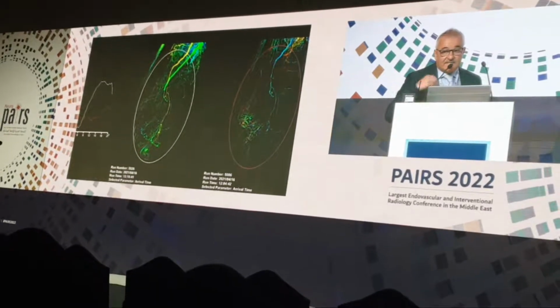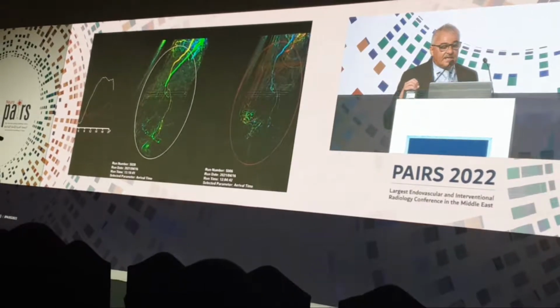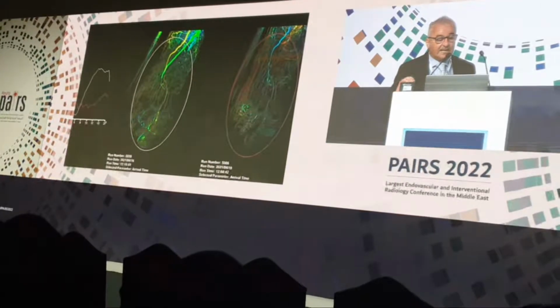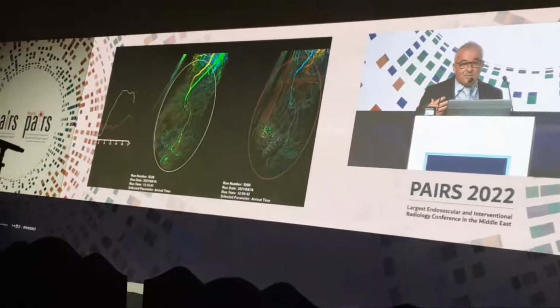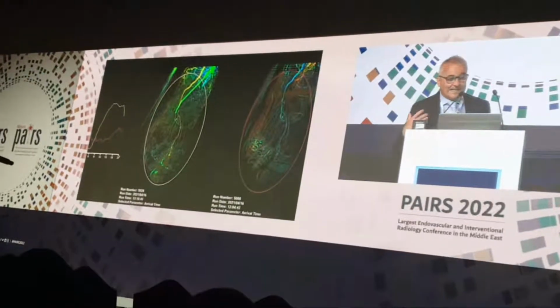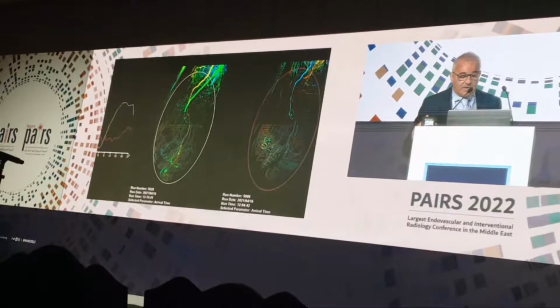Especially when we have SAD patients with MAC 3 calcification, the outcome could be very poor, despite a good acute result like this. We have to expect an early reocclusion and a very bad clinical behavior in the patient.